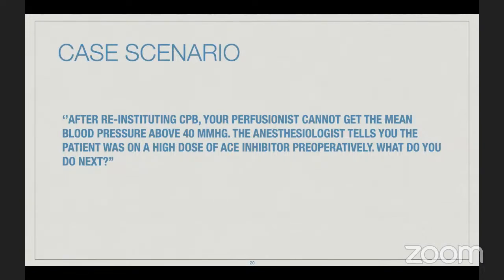the other source of air embolism into the aorta is mostly maybe the vent. Instead of sucking out the air, it might introduce air to the aorta. This is part of it.